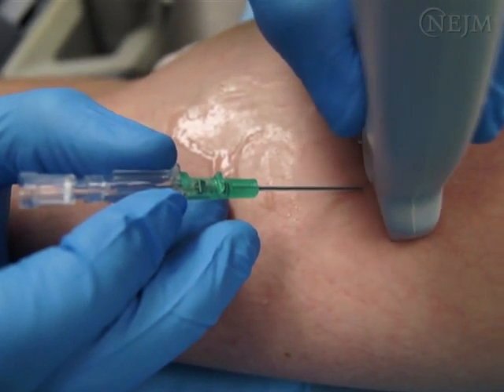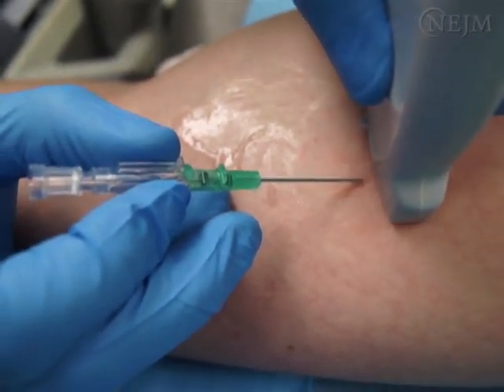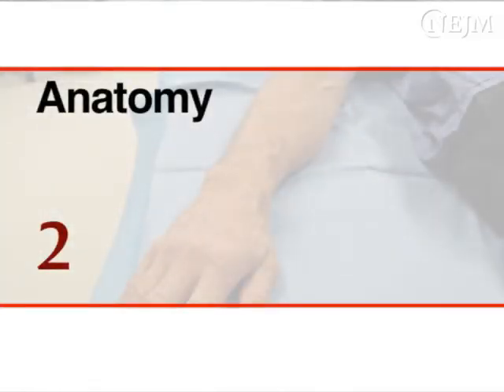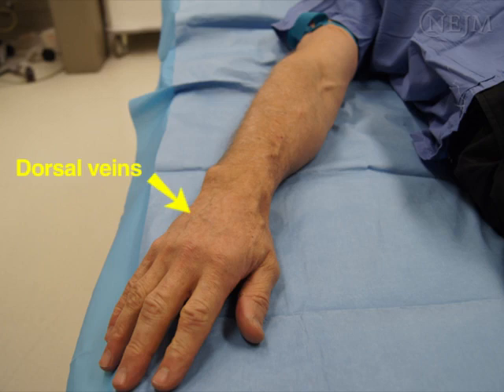We will limit our discussion to the upper extremity veins, but the same techniques can be used to cannulate any peripheral vein. To find the best site for an IV catheter, it is important to know the venous anatomy. The metacarpal and dorsal veins on the hand are good sites for initial cannulation attempts.